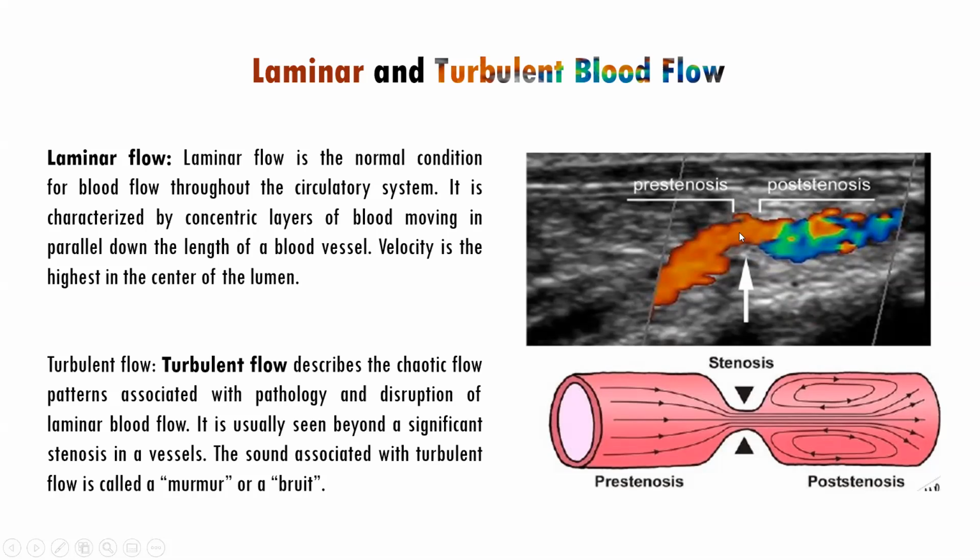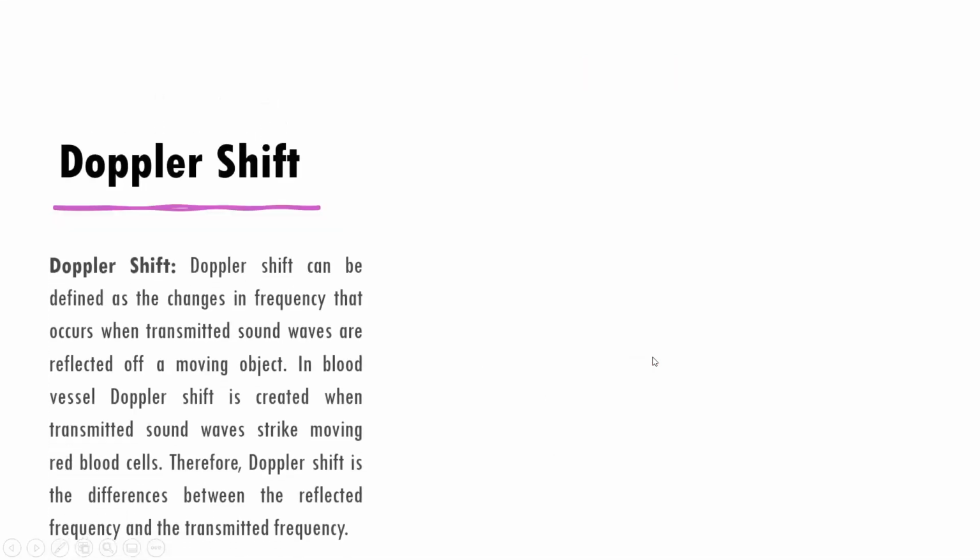Okay, so this is laminar flow, then stenosis, then you will get turbulent flow.